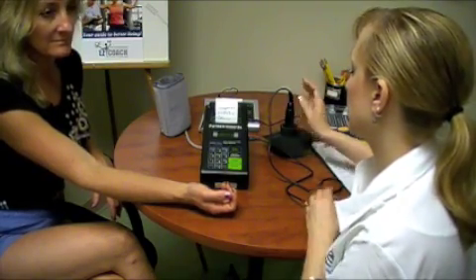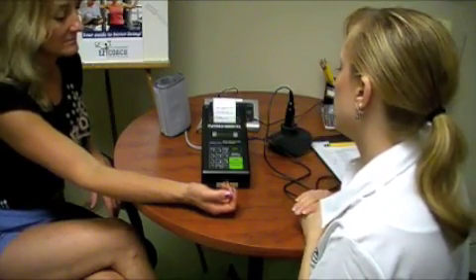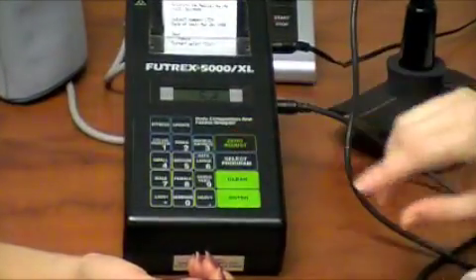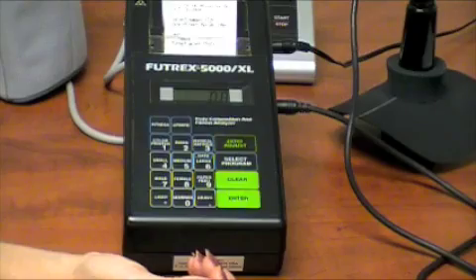Turn on the Futrex, making sure the wand is in the holder. When you see SD on the screen after the countdown, press 0 Adjust. When 0.0 is displayed on the screen, press Enter.